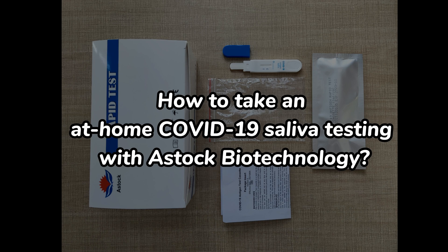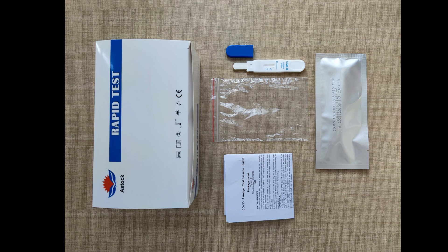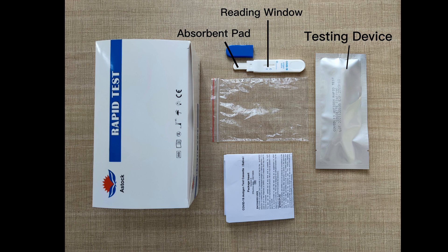How to take an at-home COVID-19 saliva testing with HERO technology. One-step rapid test. It's a simple and fast saliva antigen rapid test for everyone. One complete test kit includes a testing device with an absorbent pad at one end and a reading window at the other. It also provides you with a clear plastic Ziploc specimen bag.